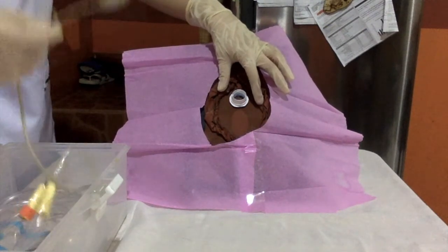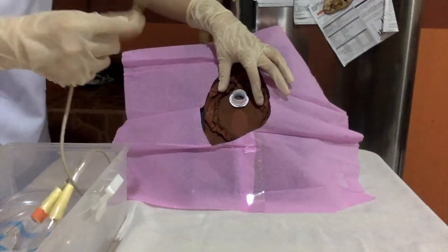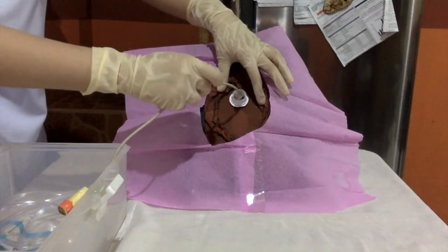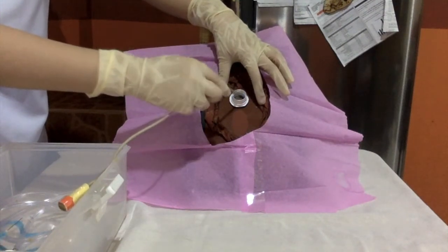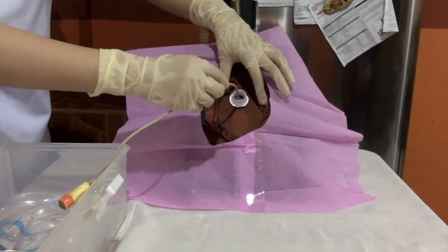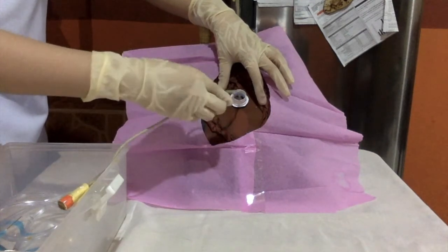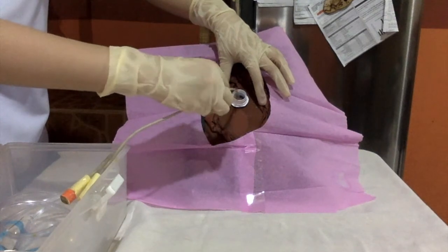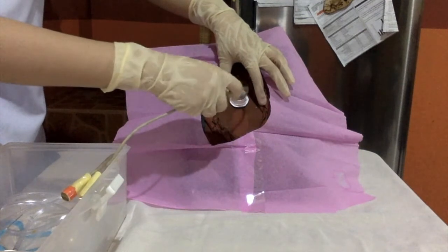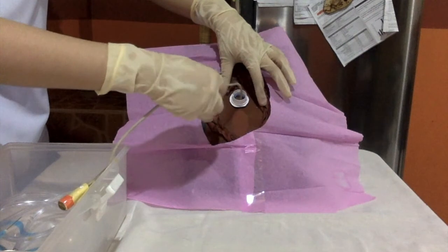Miss Smiley, iri po ng kaunti at hinga po ng malalim. Okay. And now I will insert the tip of the catheter. I will insert it slowly through the urethral opening 3 to 4 inches or until the urine returns. Iri po ng kaunti at hinga ng malalim. Ano pong nararamdaman nyo?